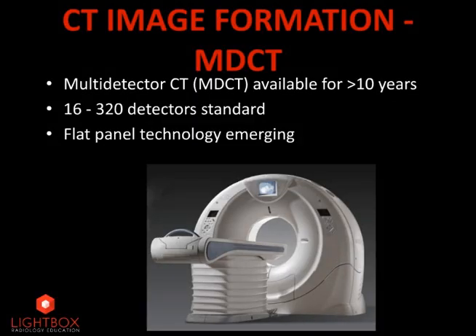All contemporary CT scanners use multiple detectors. The original scanners produced in the 1970s used a single detector. A single scan was performed in up to 30 minutes, with processing times up to 2 hours. With today's multi-detector scanners, examinations can be performed within seconds and processing times within minutes.